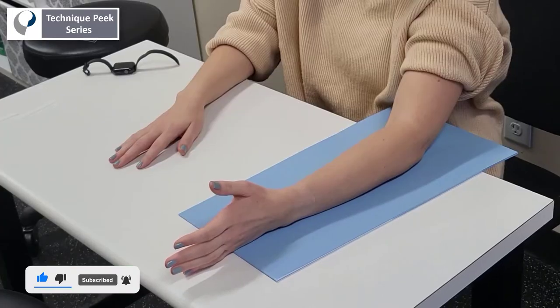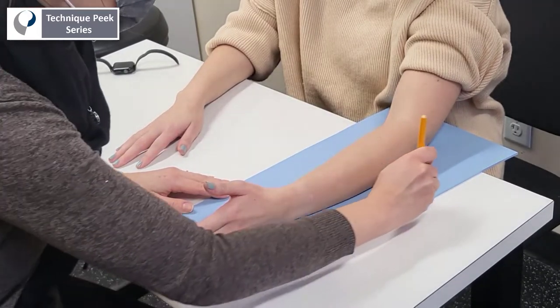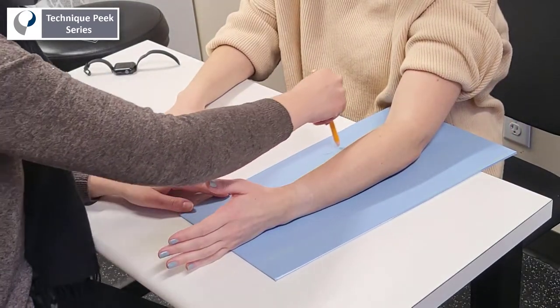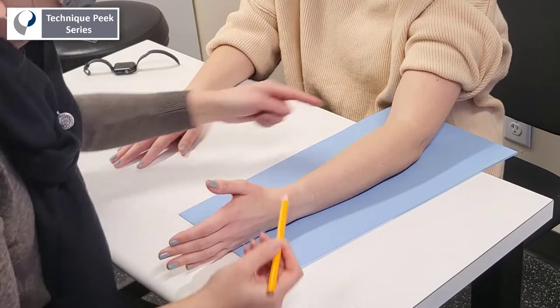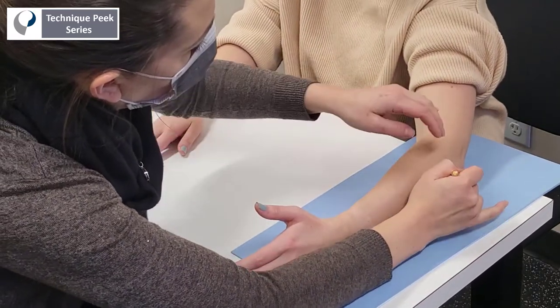To make the pattern, you'll want to position your patient with the forearm in neutral on top of a rectangular piece of splinting material. Line up the distal end of the material with the distal palm or crease. Angling your splint marker slightly away from the patient's hand and forearm, trace the length all the way to the back of the splinting material.